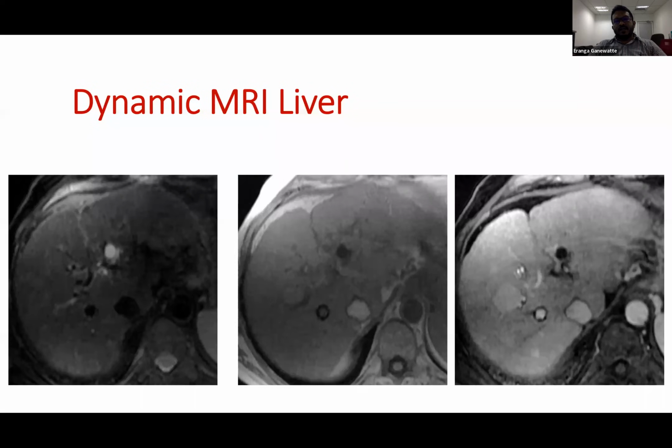This is the only tumor that you would go ahead and treat based only on imaging without any biopsy, so you have to be 100% sure before you embark on any mode of treatment in these patients. As you mentioned, we have seen several cases of intrahepatic cholangiocarcinoma in a cirrhotic patient, and it was difficult to diagnose based only on CT.